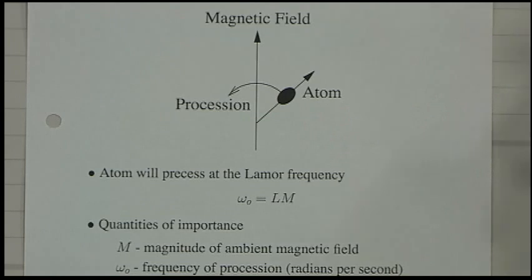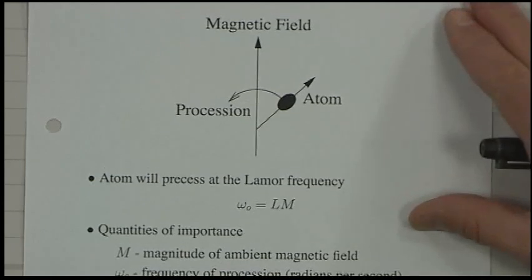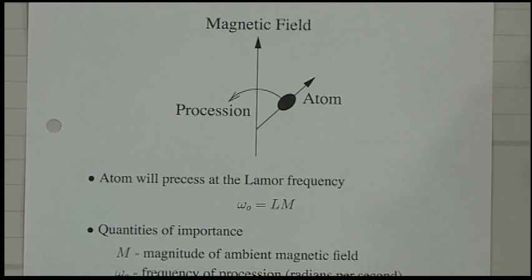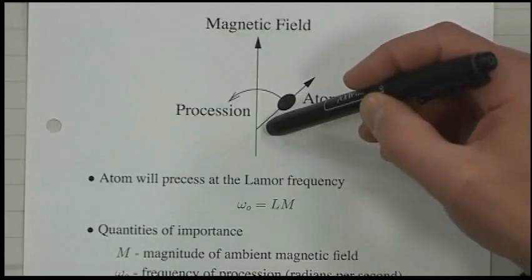There are some very specialized cases in which there are interactions between nuclear and chemical properties, but for the most part they're independent, because nuclear properties have to do with the underlying structure of the nucleus, and chemical properties have to do with the interactions of electrons. So you can bond it to other things and make other materials out of it, but in the end, you're really looking at the protons.